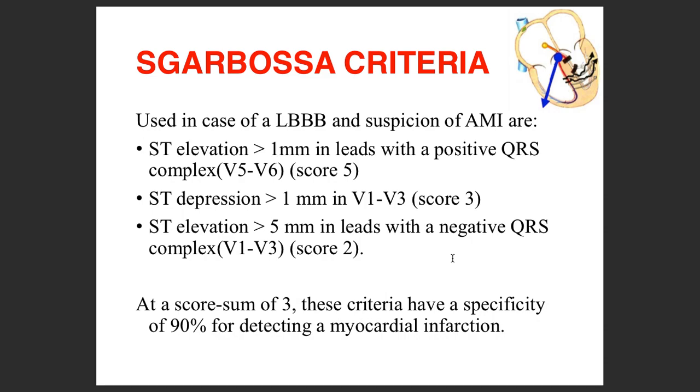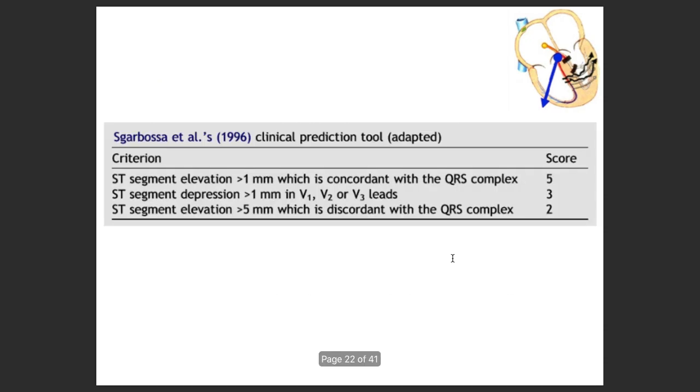So now, I hope you're aware of the Sgarbossa criteria. We did already revise about it. Please be comfortable.